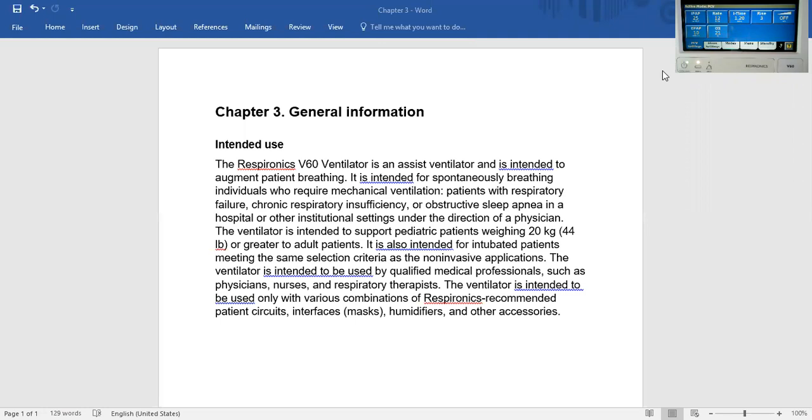It is intended for spontaneously breathing individuals who require mechanical ventilation. It goes on to state it is also intended for intubated patients meeting the same selection criteria as the non-invasive application.